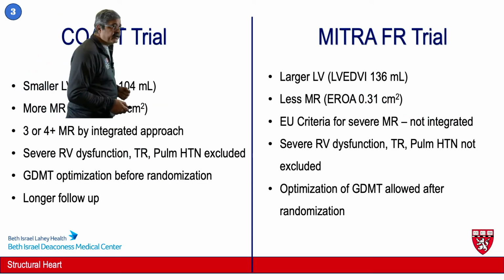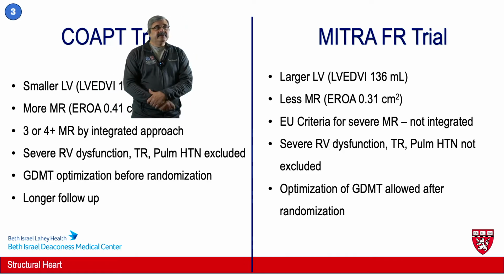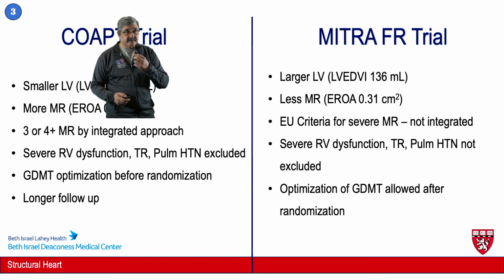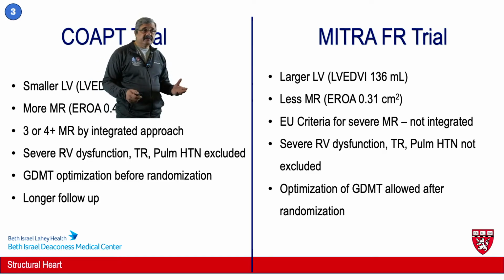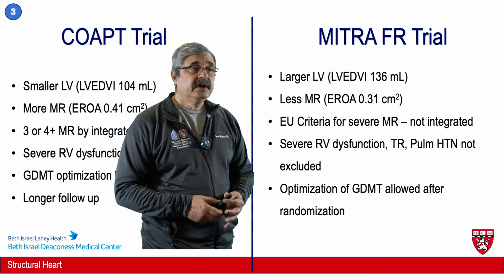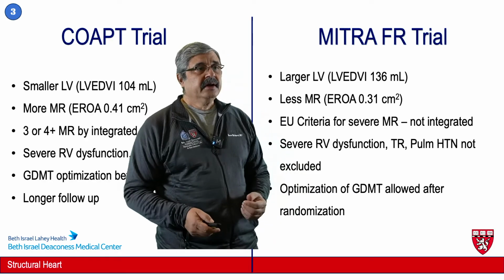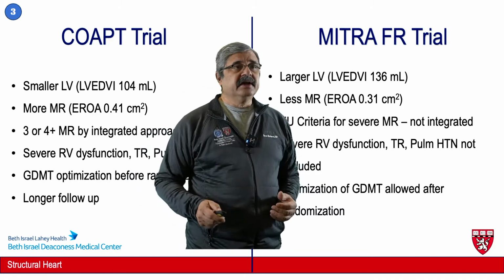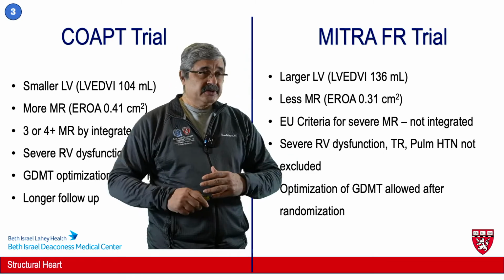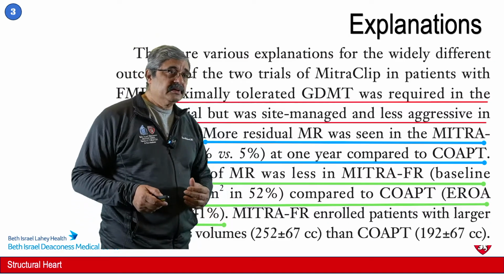Now, as you can see, there were significant differences between the two trials. One of the most important ones is that the COAPT trial, which demonstrated the benefit of MitraClip, was funded by Abbott, whereas the MITRA-FR trial was funded by the French government. The patients in the COAPT trial had smaller left ventricular end diastolic volume, which is a very important thing that we need to reconcile, and we'll find that out later on. They had more mitral regurgitation, which is counterintuitive, but they still did better. There were minor differences in the guideline-directed medical therapy and inclusion and exclusion criteria, but none of them was big enough to get these trials to end up in exactly opposite directions.